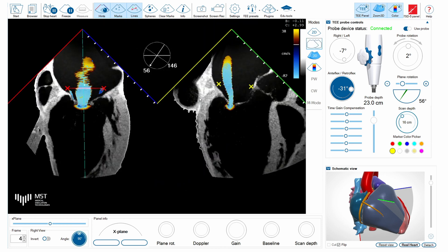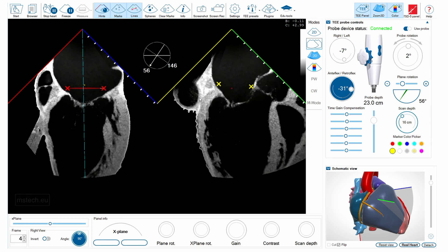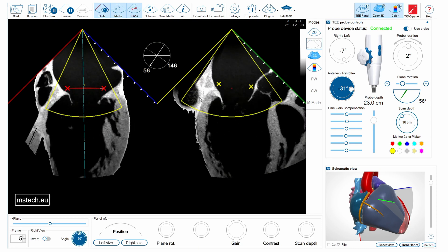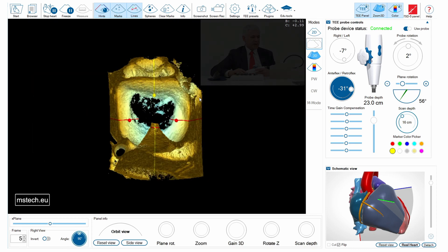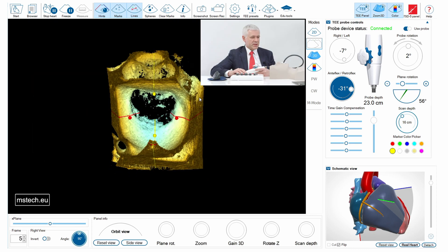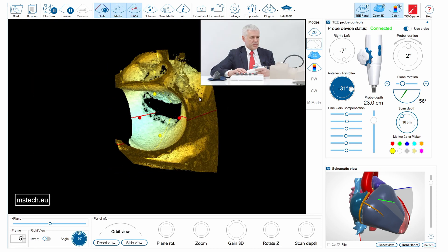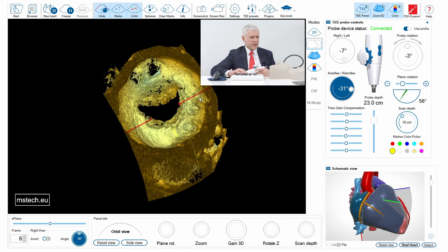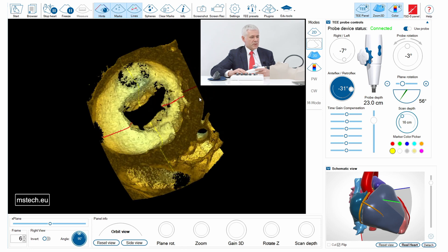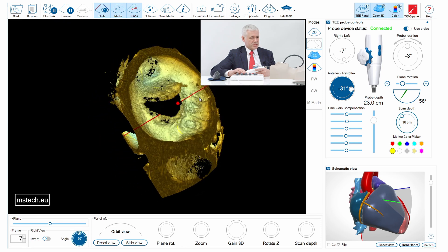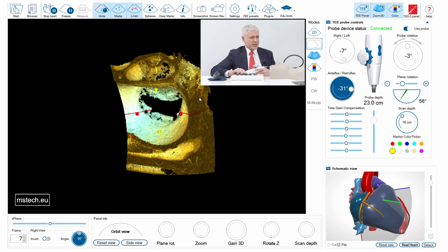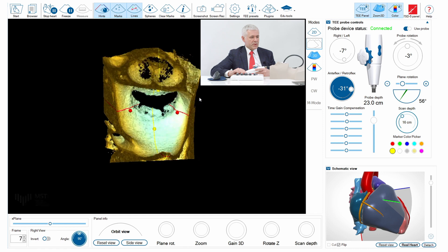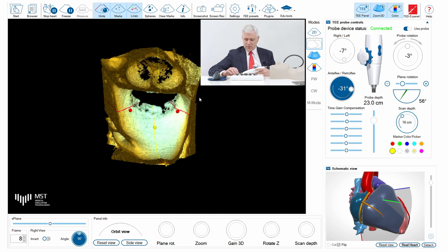You can also appreciate some anatomical details, like little clefts between the P1-P2 and P2-P3 segments, which gives you a lot of realism when looking at the anatomical structures.